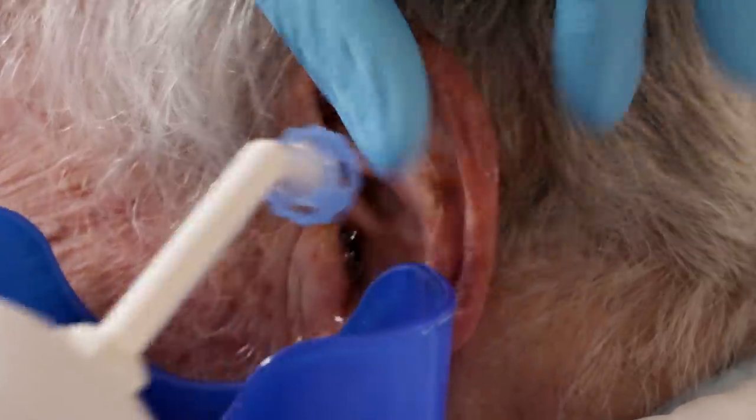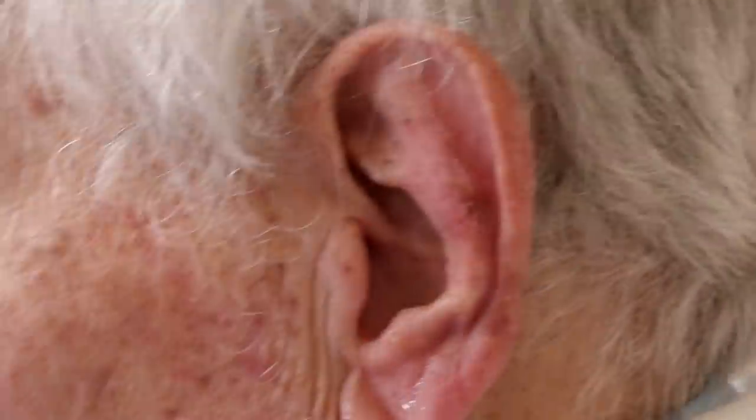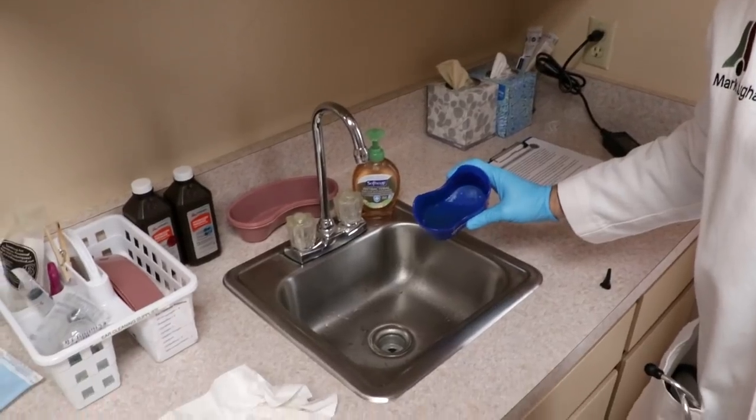Oh wow, whoa — this is full of water. Or it should be — that's a lot of wax in there.